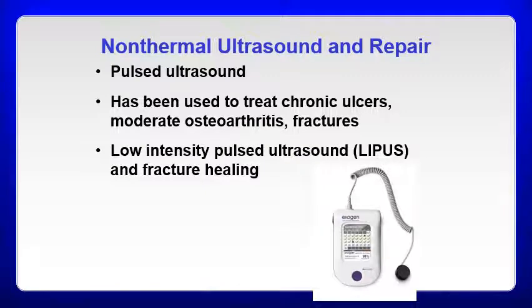And probably more recently, in the last few years, they've started to look at what's called low-intensity pulsed ultrasound with fracture healing. If you look at this picture here, this is a different type of ultrasound unit. It still uses sound energy, but it uses extremely low intensity, lower than even what you would get on the machines that we're going to utilize.